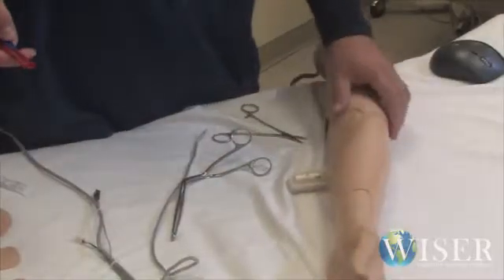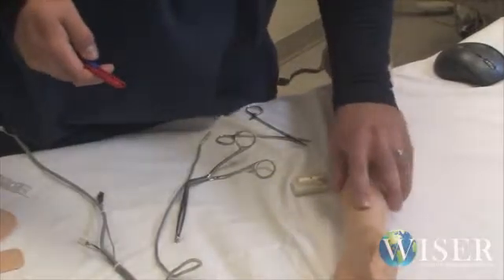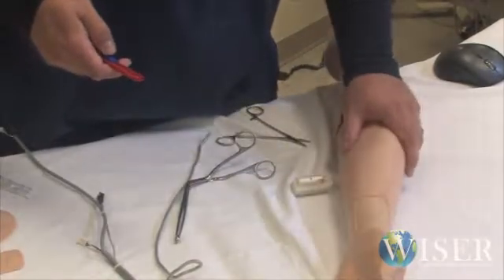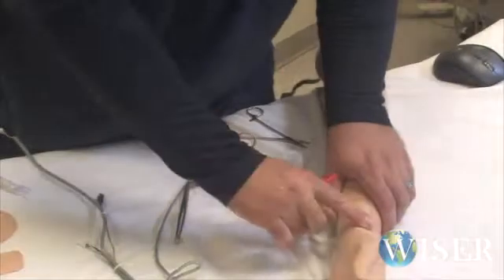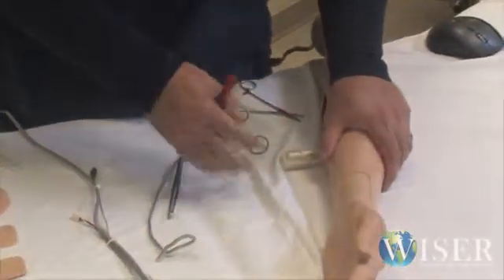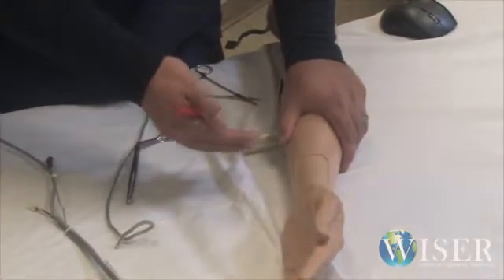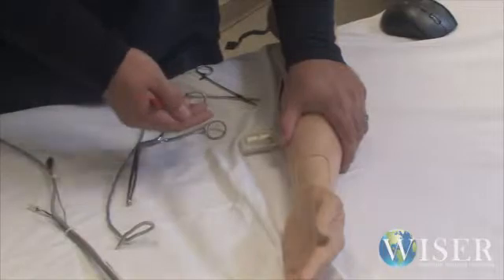So the first thing you want to do to get into where the module lives is take the skin flap off of the simulator's arm. You can use your fingernail to get it up, or you can use a razor. But the important part is to not just rip it off, because they can tear and then they're useless.